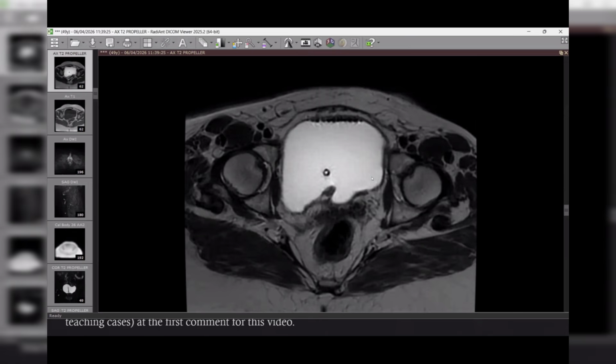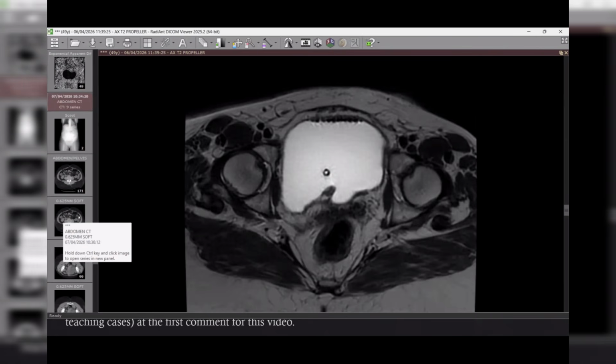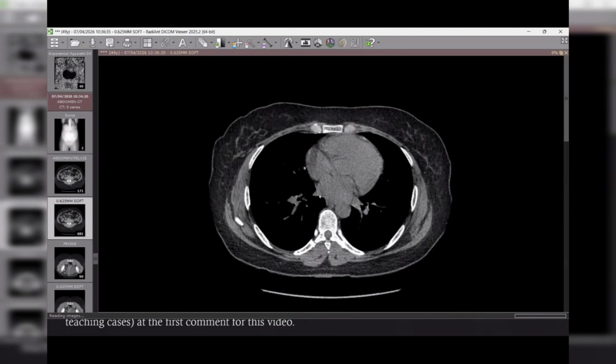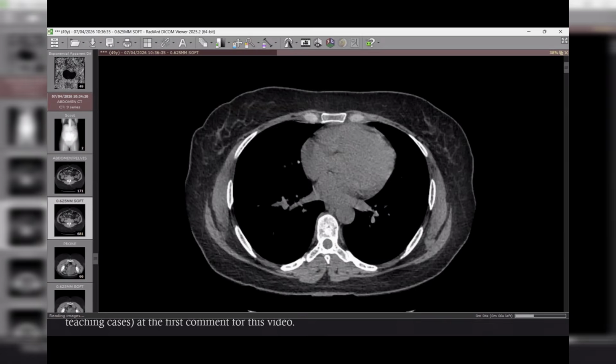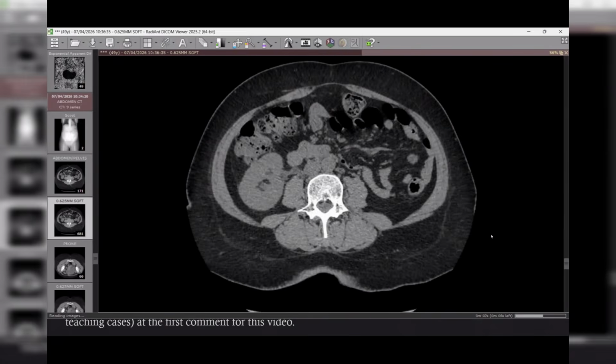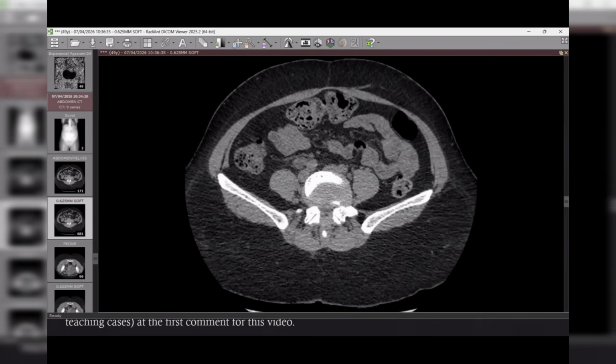I'm talking about the radiology. Can we have a CT urogram? CT, okay. I will give you the CT. Maybe helpful. Okay, this is the CT for the same patient. Yes, you can scroll. You have only 2 minutes to give me an idea. I'm sorry to put you under pressure.